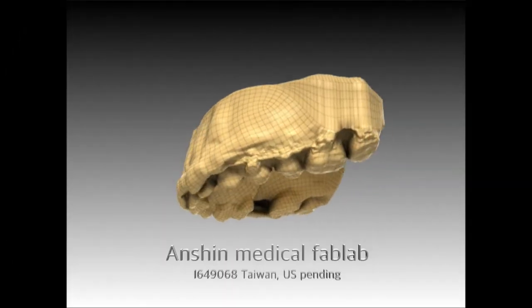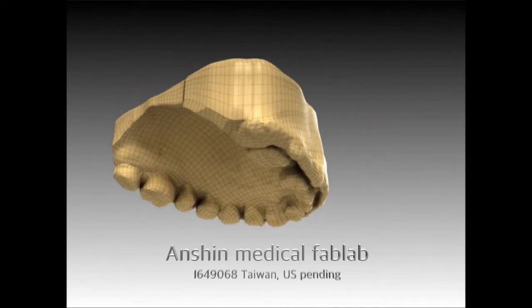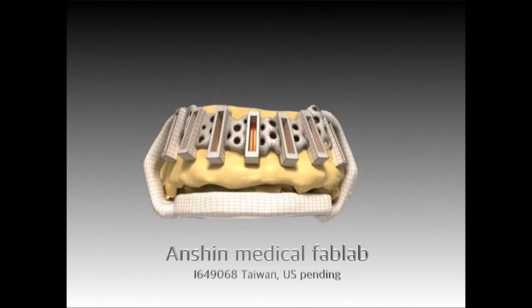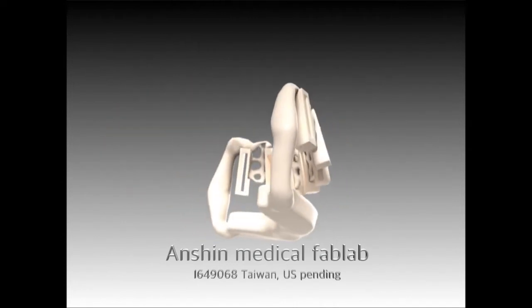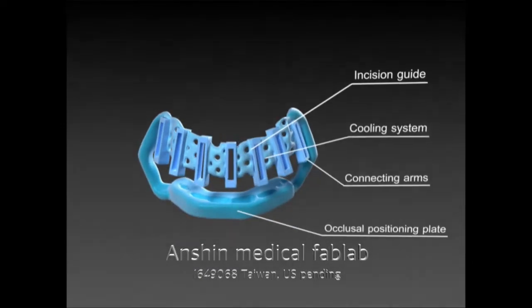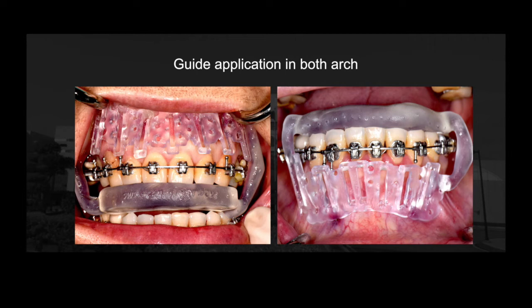The CAPG was digitally designed and characterized by a buccal slot for performing piezocision in precise location, depths, and angulations. A draining system with multiple pores and drain tubes was designed for great access of copious saline irrigation to the surgical site. Finally, the guide was printed by a desktop 3D printer with transparent material to facilitate increased visibility. After sterilization, the CAPG was positioned intraorally by the occlusal plate part in the patient's mouth, and the stability and fitness of the CAPG were checked before surgery.